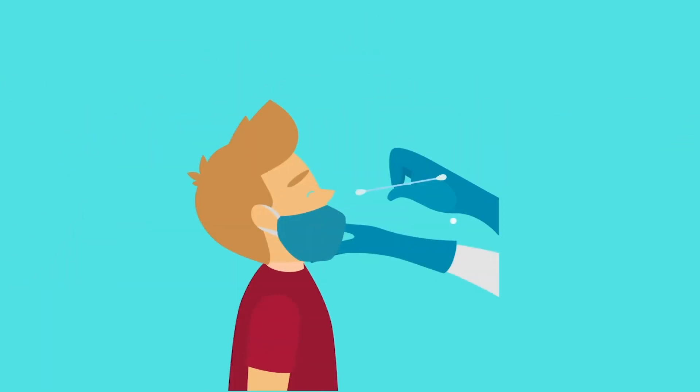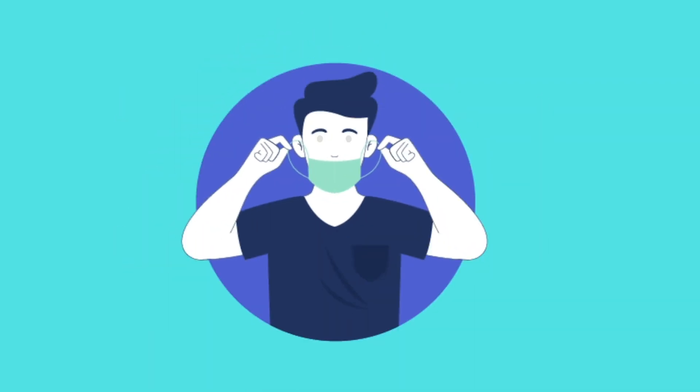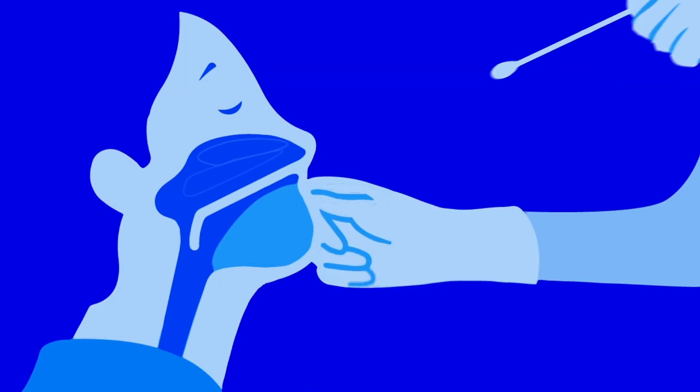To do this, tilt the patient's head back, ask him to lower the mask to the level of his mouth and close his eyes. Gently insert the collection swab just above the floor of the nasal passage into the nasal pharynx until a resistance is felt. The swab should be straight and parallel to the palate. When you start to feel resistance, do not force it and gently roll the swab in the nasopharynx four to five times on the wall. Gently pull the swab out of the nostril. The patient should not feel pain during the procedure.